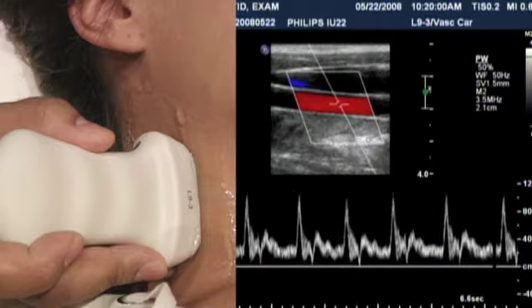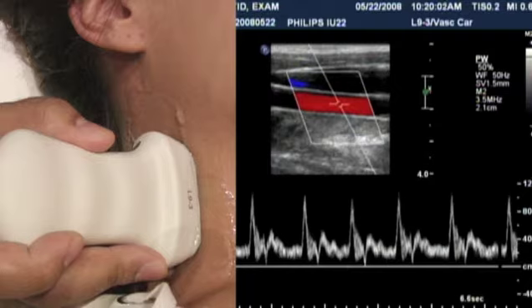The other thing I want you to note is that, I'm just going to put a pointer on here, the end diastolic flow velocity is calculated at 100 milliseconds prior to the start of the systolic upstroke, which should be somewhere in this area. You don't necessarily have to get a caliper out to make that measurement, but you have to be sure to get your diastolic velocity measurement somewhere in this area. Shouldn't be anywhere else. I've seen some techs make the mistake of measuring it here or in other places. Should always be measured somewhere in this area right here.